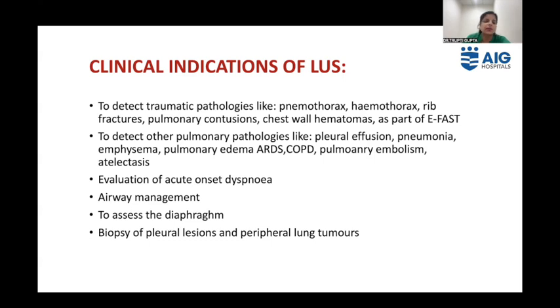It can also be used for evaluating an acute onset dyspnea and can also be used for airway management, that is to confirm the placement of the ET tube, to rule out the endobronchial intubation, to assess the diaphragmatic function, and biopsy of the pleural lesion and the peripheral lung tumors.